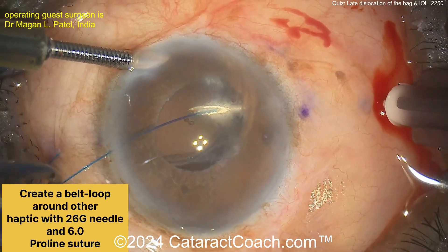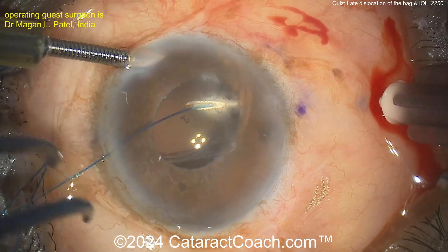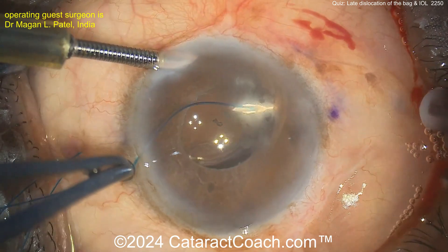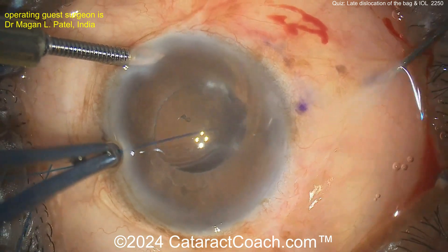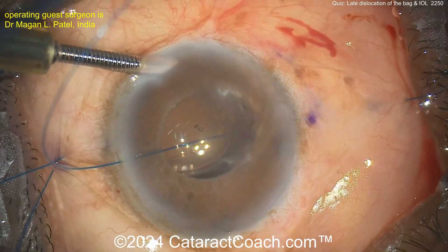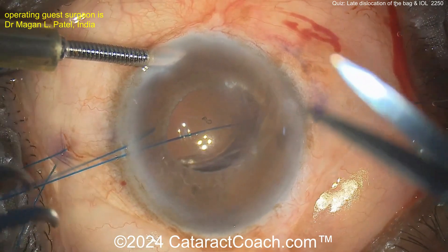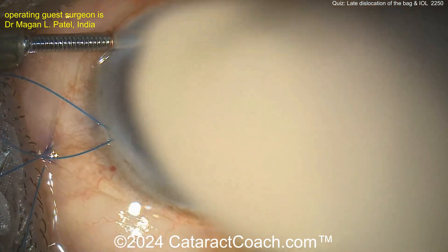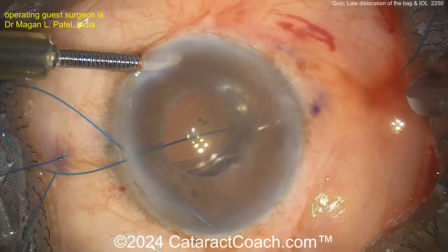Now here's the opposite side — again threading through that 6-0 prolene suture, pushing it right through and extracting it. You want to be about two to three millimeters behind the limbus. Don't go too far back. I wonder how far back that one pass goes — maybe it's just under the conjunctiva and doesn't enter the sclera until a bit later.